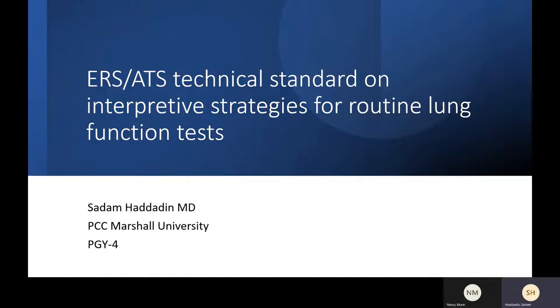If you want to think about the Z-score, just go back to internal medicine and think about bone density. When you do a bone scan, it comes with a Z-score. And the Z-score is the score, the mean, the zero for that patient within his age group. This is the big difference. When you have a patient who is 85 years old doing PFT, it will not compare his data to the old data. Now he's going to be compared to the normal 85-year-old patients, to the normal of his age. So this is why you cannot use percentage, because the percentage would go to the whole population.